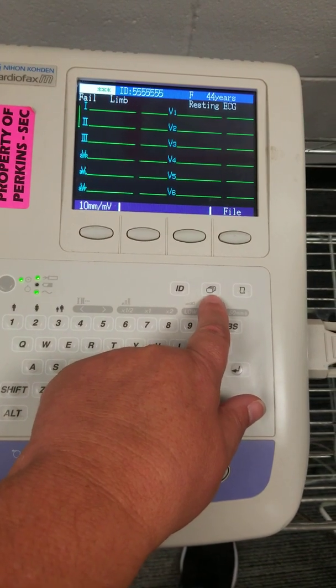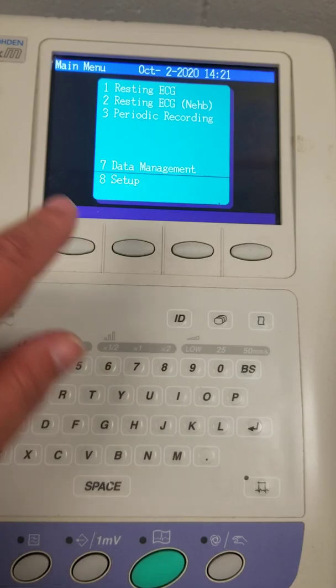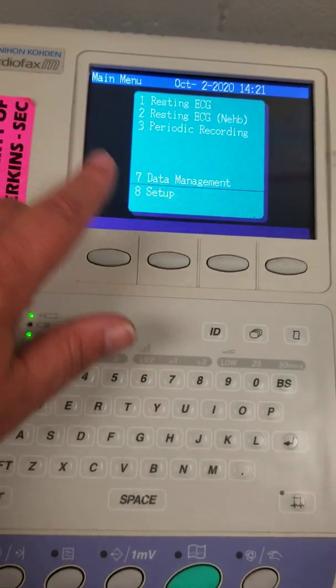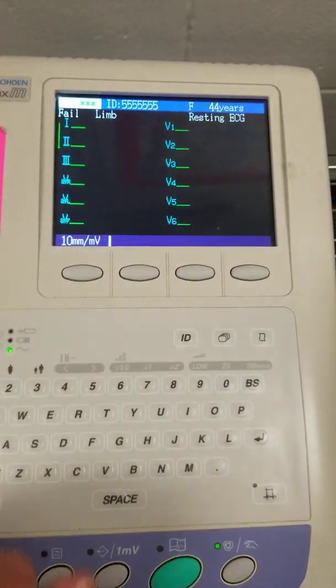If that occurs, you're going to hit this button here that has the three files on it. Then you are going to choose number one by clicking one, and it will go back to what it is.